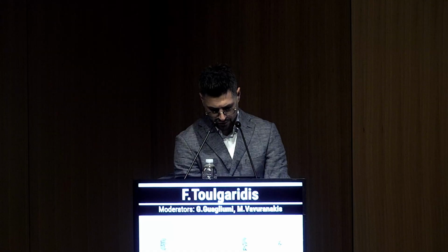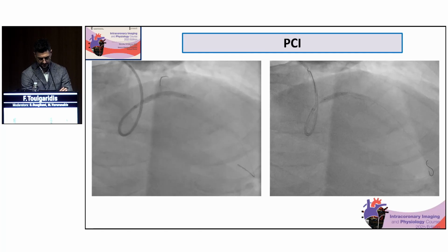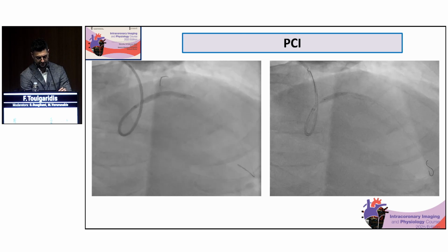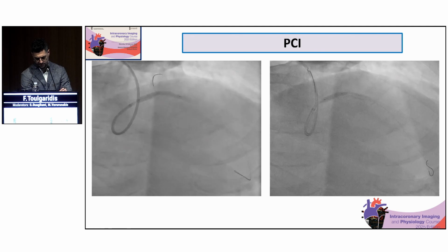And perhaps also the enhancement technology in the future might help more and more in getting the calcification spot after the lesion preparation. Let's go ahead. Okay, let's follow with the case. Excellent comments. So this is a stent deployment, fairly enough deployed, but I see your point that maybe there is an under expansion. Afterwards, we finished with a POT. We used the POT balloon of NC 4.5 by 12 millimeters, and we inflated up to 16 atmospheres.